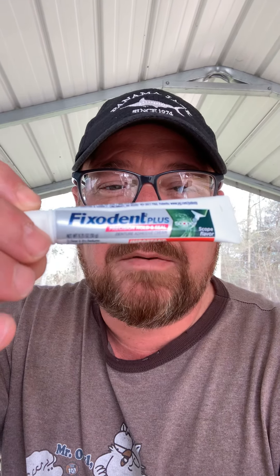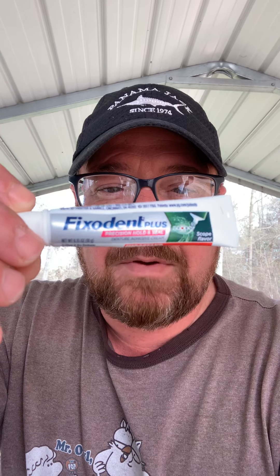This morning I decided I was gonna try the adhesive for the first time. You can't put the adhesive anywhere near your extraction sites, but that's basically what I'm making this video for — I used the Fixodent Plus, first time using adhesive.